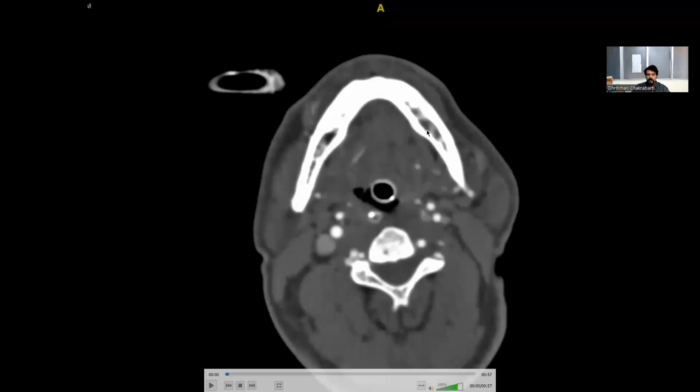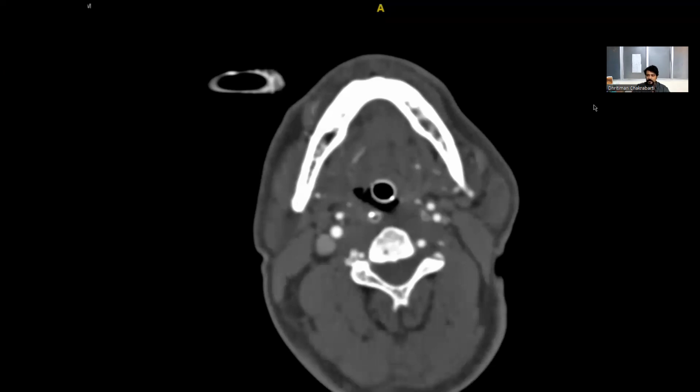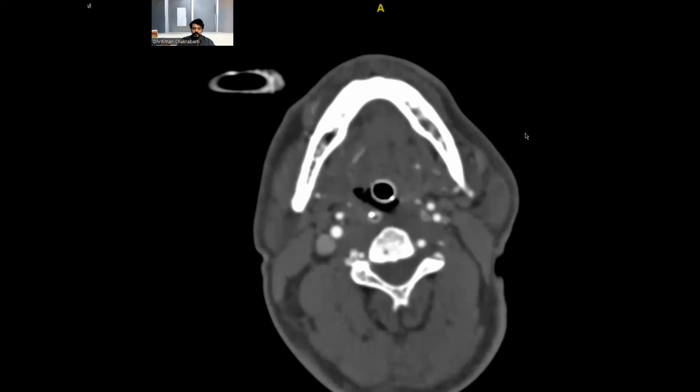All right. So, here I have a case of the vertebral artery dissection. But let's at least have a brief discussion before I jump onto the CT scan part. Inside our brain, the arterial anatomy is divided broadly into two parts: one is the anterior circulation, one is the posterior circulation. The anterior circulation is comprised exclusively of the two ICAs, the two internal carotid arteries.